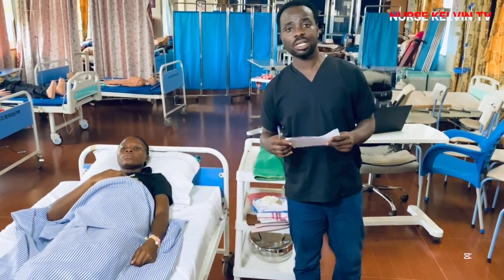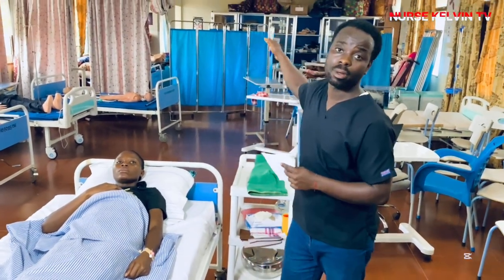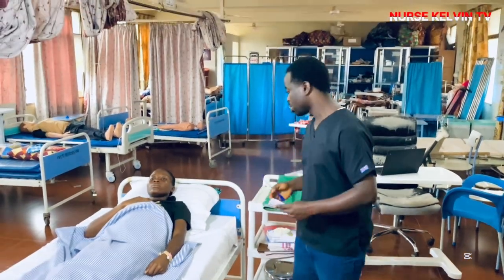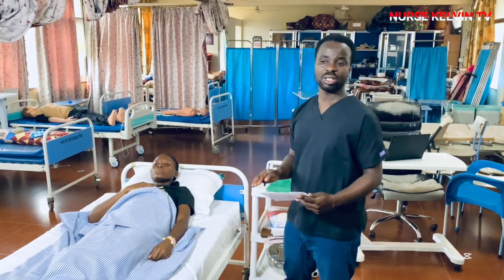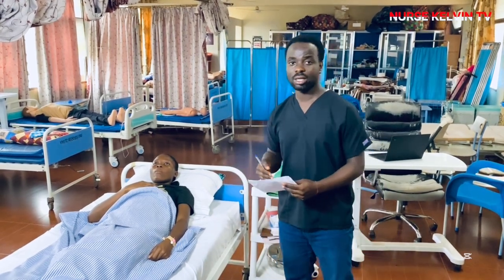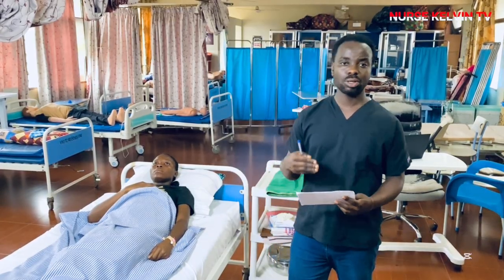So guys, I'm done with the first check. Then the second check, we are checking at the nursing station. Right time, right patient, right medication, and then the right dose.